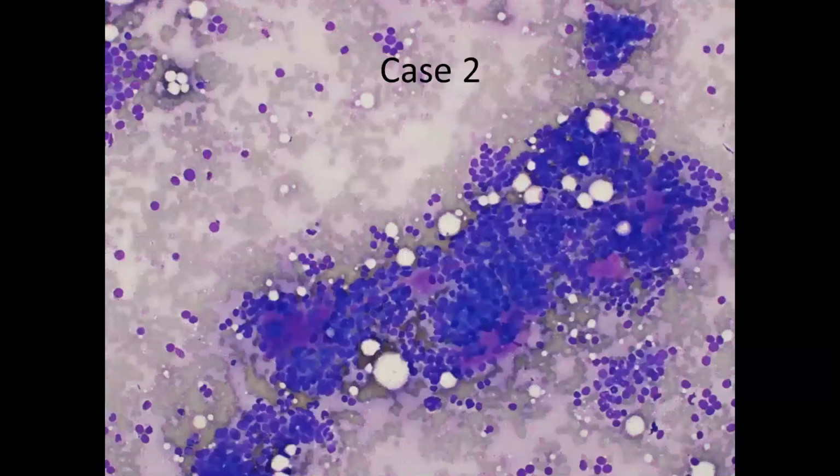Here's another FNA, salivary gland lesion. You can see again, we have a very cellular aspirate. We have these clusters of basaloid cells with bland nuclei and high N/C ratios. And again, we have a little bit of this interposed hyaline stromal material that is sharply demarcated from the basaloid cells. So for my money, this looks very similar, if not identical, to what we saw in our last aspirate, which ended up being an adenoid cystic carcinoma, a high-grade malignancy.